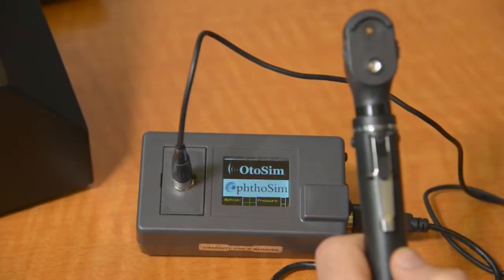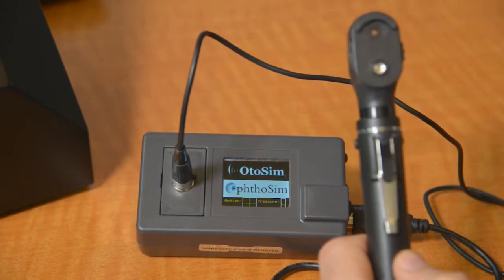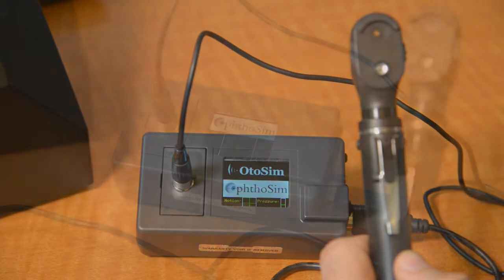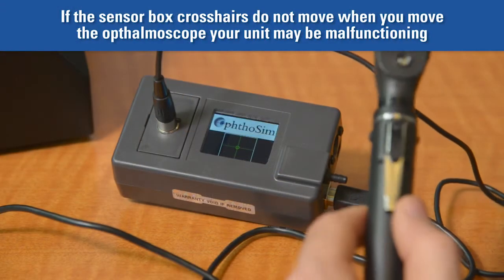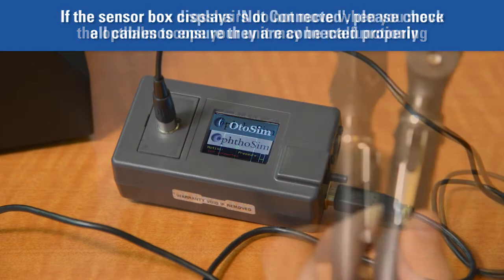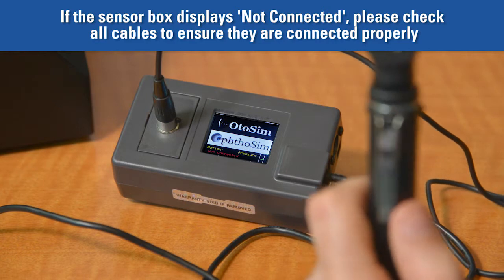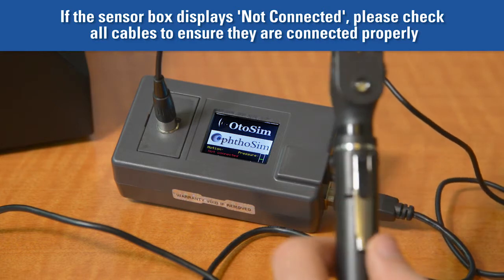The display window of the sensor box should now show a moving green crosshair that corresponds to the motion of the ophthalmoscope. The two graphs at the bottom of the display window are designed solely as indicators that the motion tracking mechanism is functioning correctly. If you do not see any motion in the green crosshairs when you move the ophthalmoscope, your unit may be malfunctioning. If your unit displays 'not connected,' you should check that the cable connections between the sensor box and ophthalmoscope are tight.